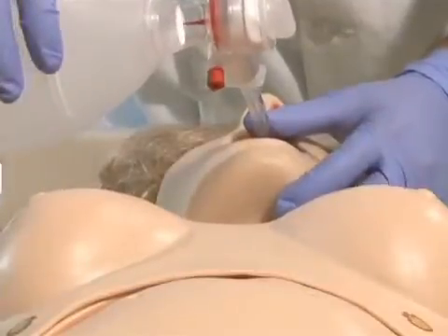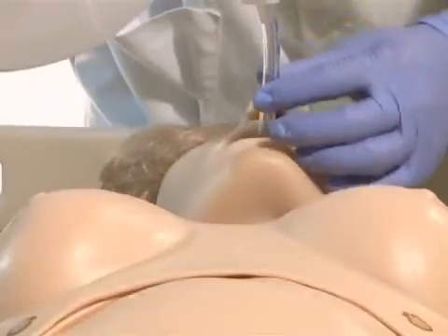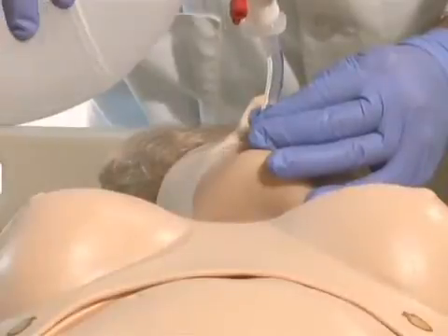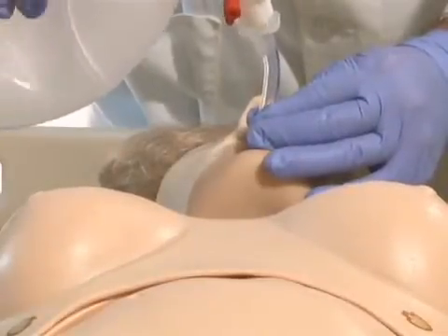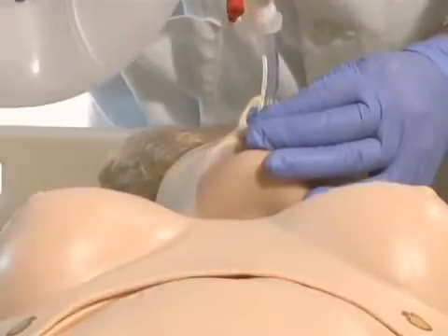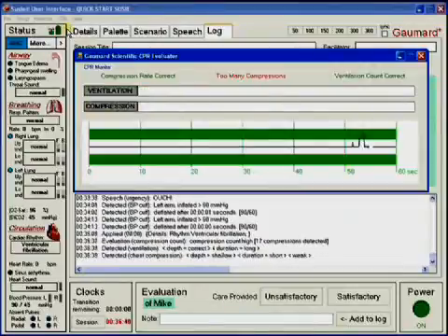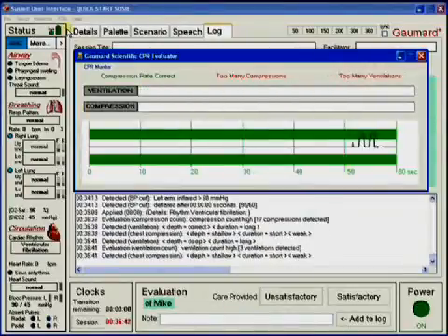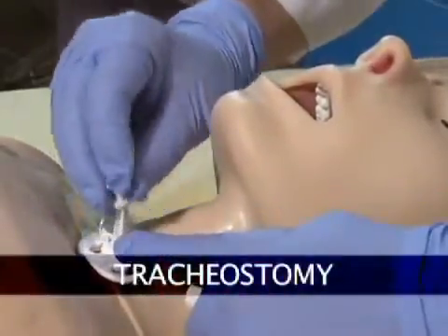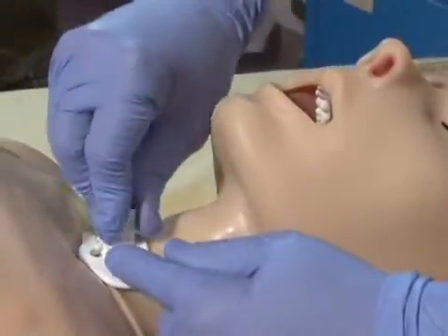Once intubated, sensors detect the depth of the intubating tube. Should the tube be inserted too deep, the left lung is automatically disabled, realistically demonstrating right main stem intubation. Correcting the tube position enables the left lung. Ventilations are measured and logged showing the instructor exactly how students are performing. If neither oral nor nasal intubation is possible because the airway is compromised, then a tracheostomy tube can be inserted.